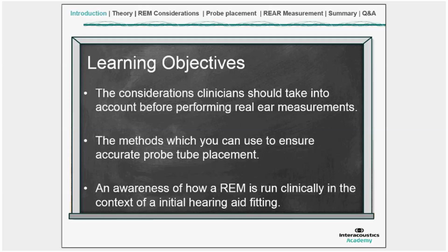After that, I will give you an awareness of how the REM is run clinically in the context of an initial hearing aid fitting. So REM can be used in several different clinical scenarios. And the initial hearing aid fitting is probably the most common way people are using REM. So I'll focus on the initial fitting for today.